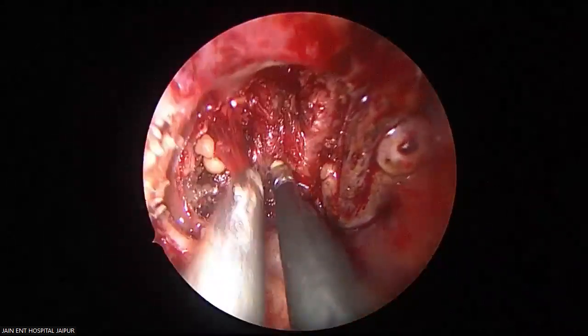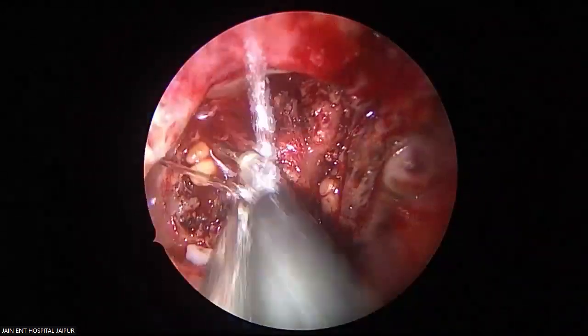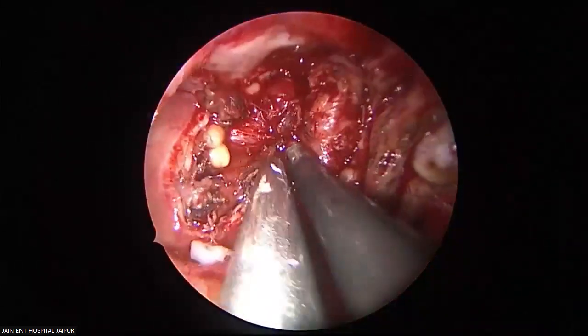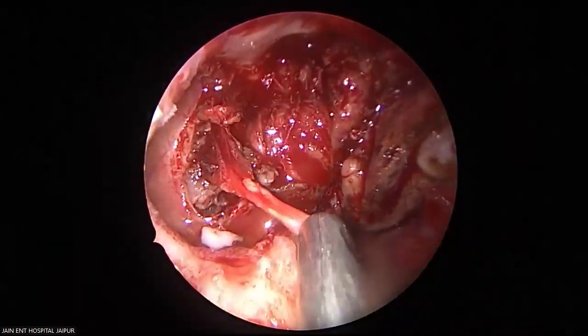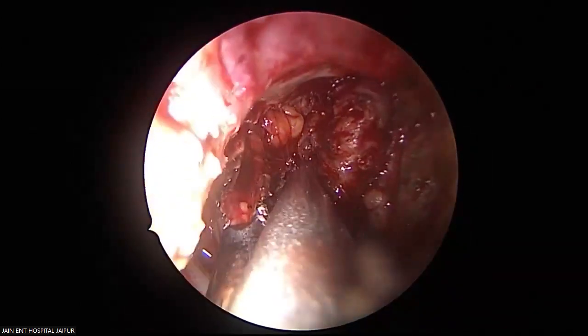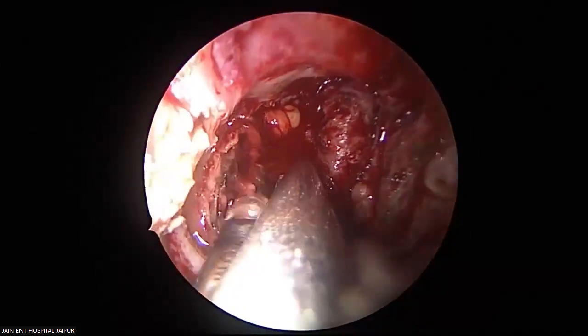So this is the exposure of the tumor, infratemporal fossa. You can see the entire surface of the tumor and see some of the fat. Infratemporal fat is coming in the view.